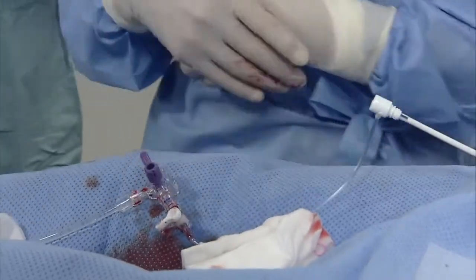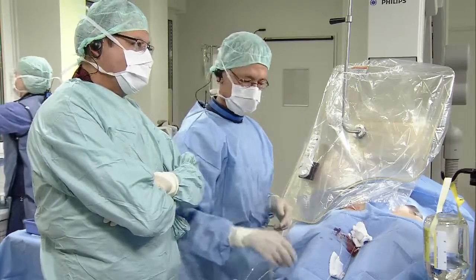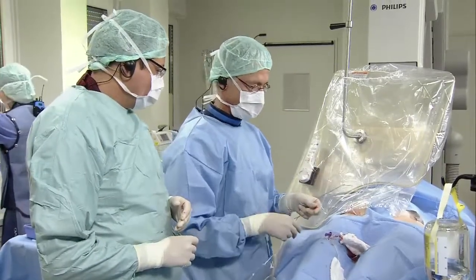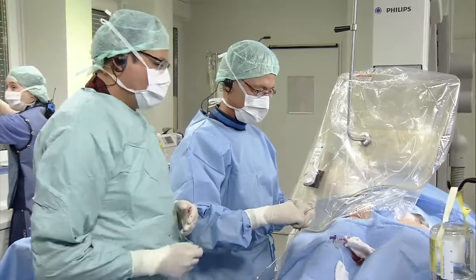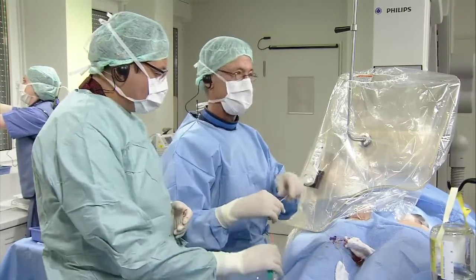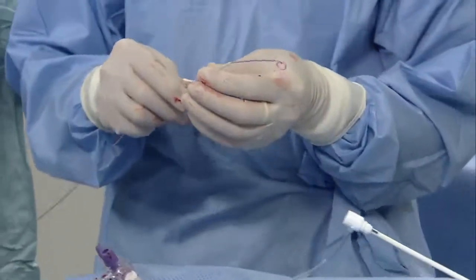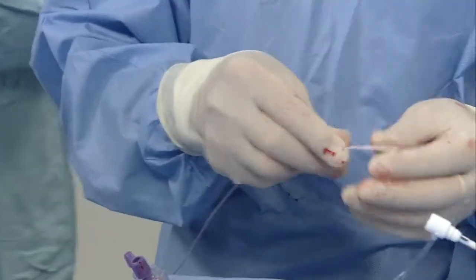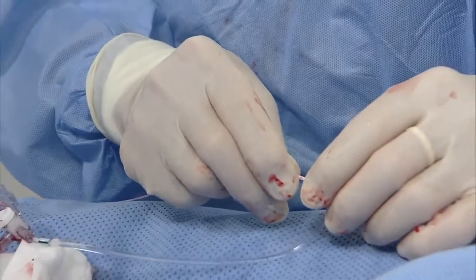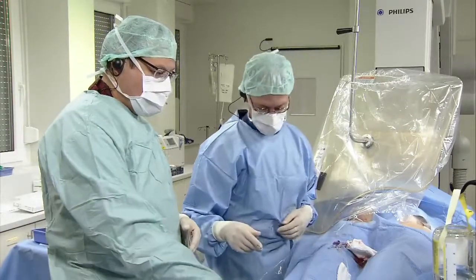Roland Rossi, you thought I'd forgotten about you. Roland, in your institution, are you concerned about left atrial pressure and fluid, or not particularly if everything else looks good? We try to get it between 10 and 20 millimeters. Thank you. Matt, you used to be an advocate of appendage volumes and left atrial pressure and so on. What would you do? This is around a mean of 4, I think. I would give a liter bolus and just continue as I go. So yes, I do check and I'm aware of the pressure and try to get it above 10.